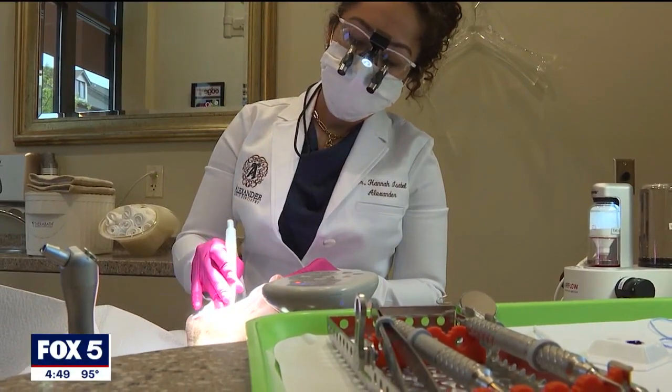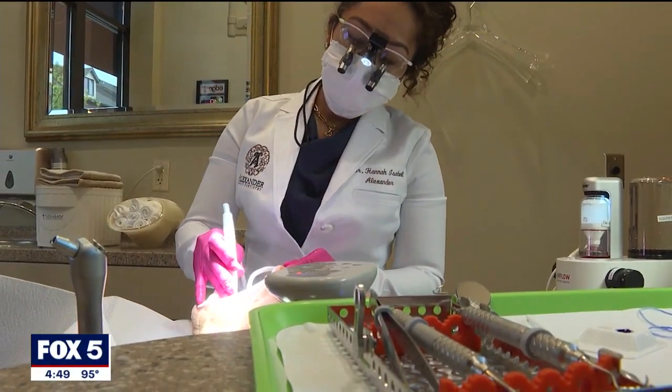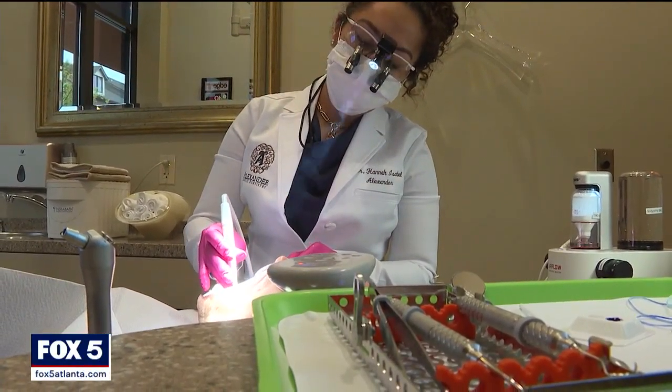An airflow cleaning can take about 30 minutes, and Dr. Alexander says it can get your smile in better shape with a lot less scraping. It allows her to get around the entire tooth, take off the calculus, and patients don't have to be numb.